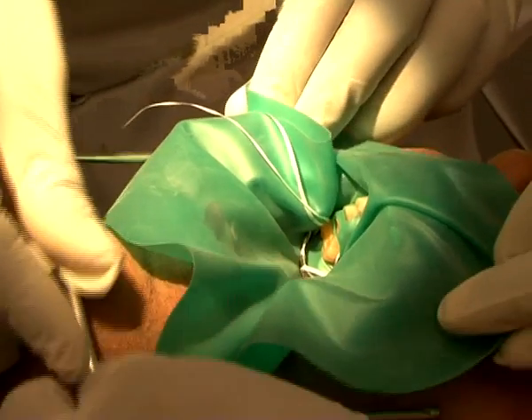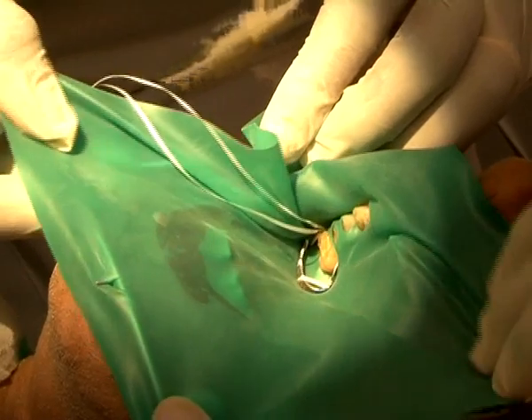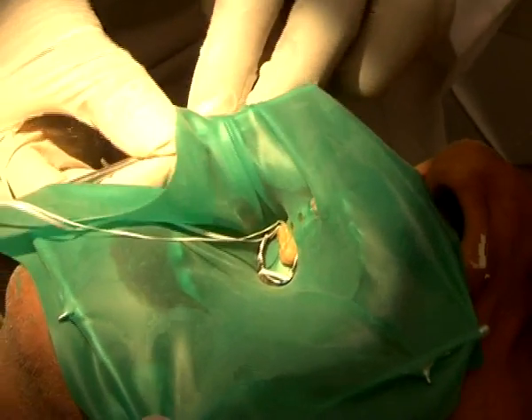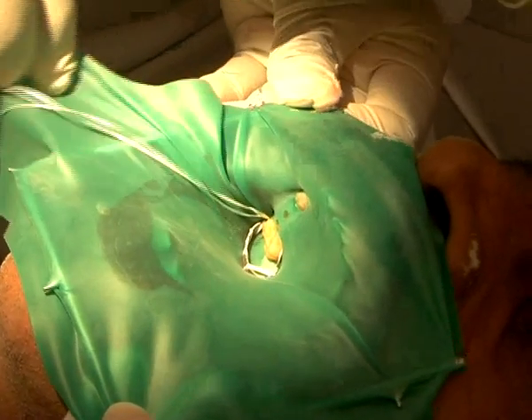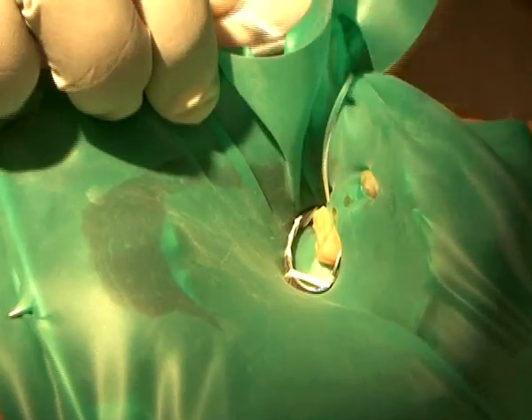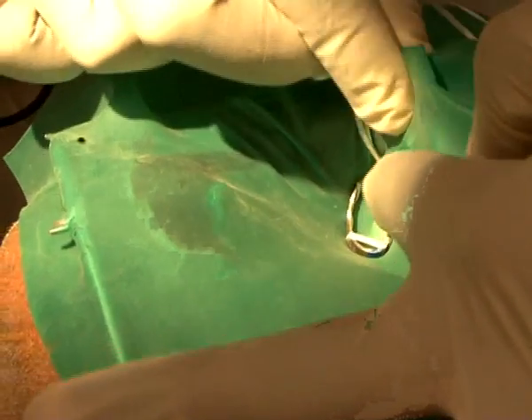Are you okay? We will slide the frame, making sure it goes under the nostril. Can we have a piece of floss?